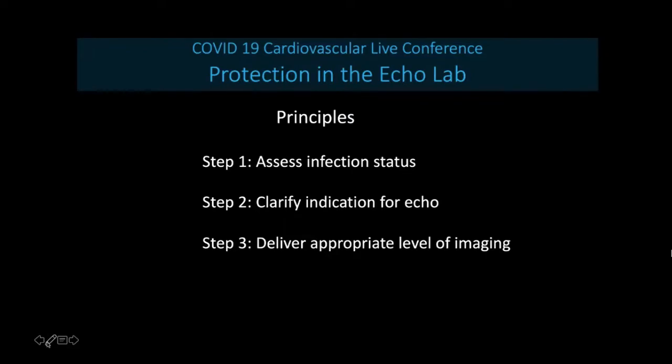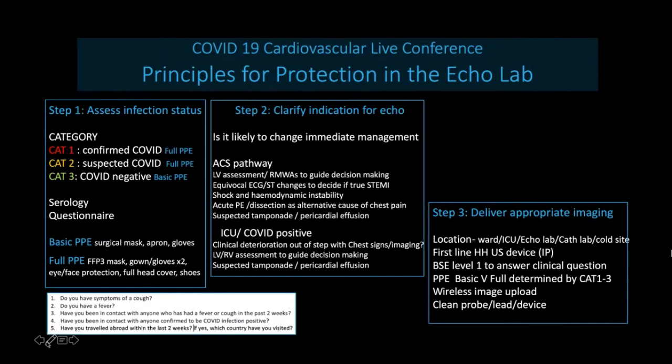Protocols that we've come out with as to how we approach our patients is a three-step approach. First, assess the infection status. Secondly, clarify the indication for echo. And then thirdly, deliver the appropriate level of imaging. And I'll clarify each section as we go along.